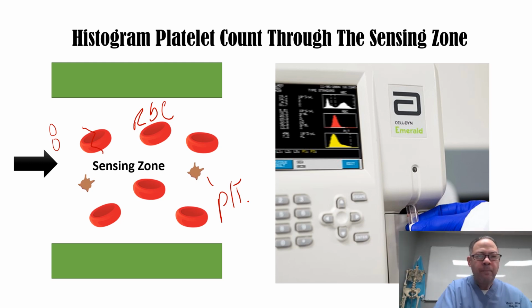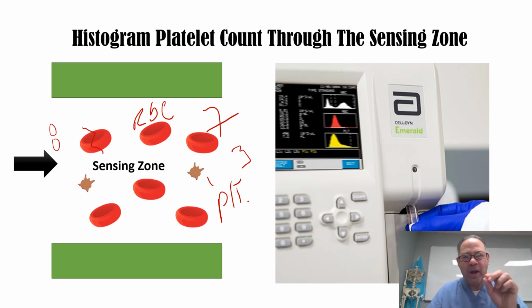Okay? So, let's say you have 7 red blood cells, and when you shake it, now you have only, let's say, 3. That is what the test result is going to report. But is that what you have? You don't have that. So, si uno coge una aguja y causa hemólisis, o uno le hace esto al tubo y rompe los glóbulos rojos, y tú tenías, por ejemplo, 7, y nada más te quedan 3 buenos, la máquina va a reportar ¿cuánto? 3. Pero ¿es verdad que tú solamente tienes 3 glóbulos rojos? No, tú no tienes eso. Eso es un error. ¿Causado por quién? Por el que sacó la sangre.